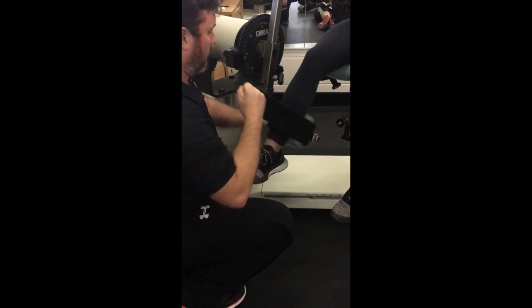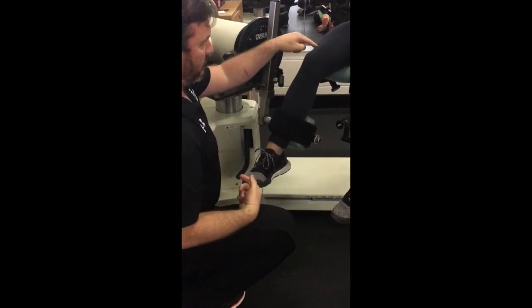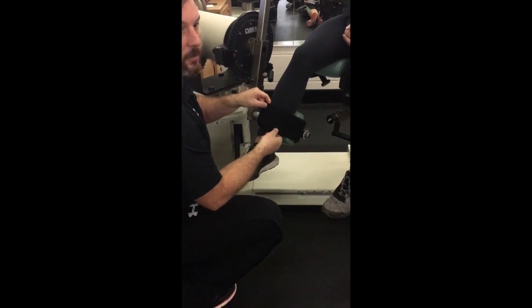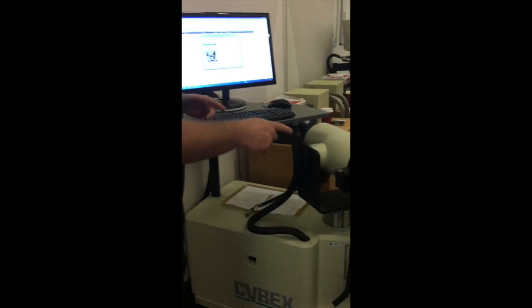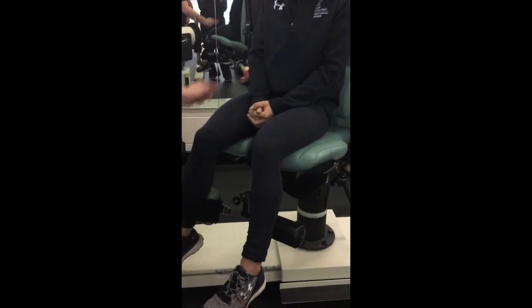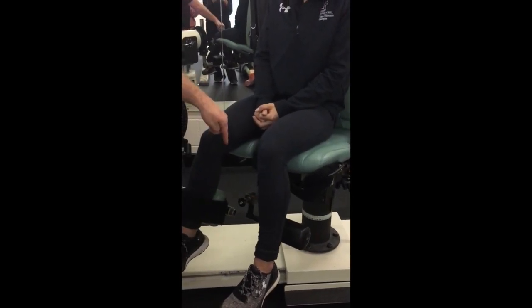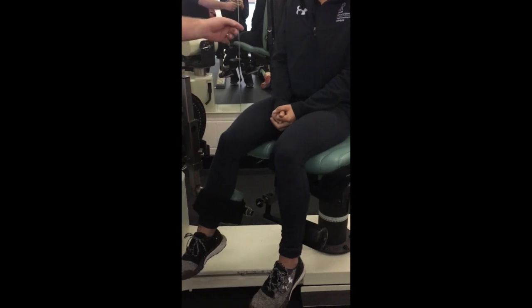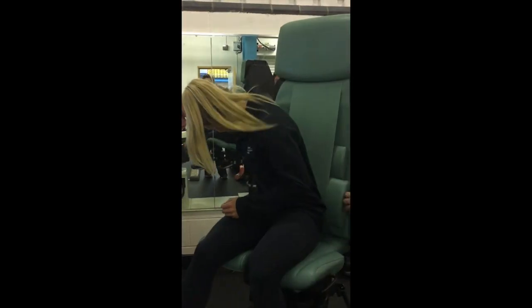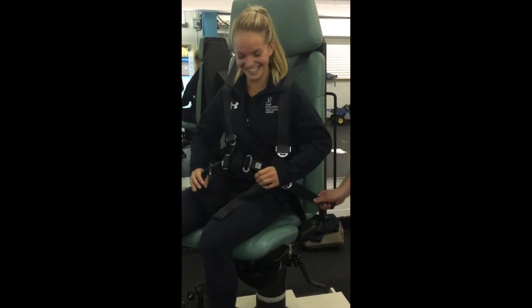Tight enough. Yeah. So if you're pushing out to test quads, you're then pushing just against the strap there, which might not be as comfortable. There's a bit more padding. There is this Velcro strap here, which you can then change either side and put across the thigh to hold it down. And then go on, put it on, and then you can tighten all the straps.